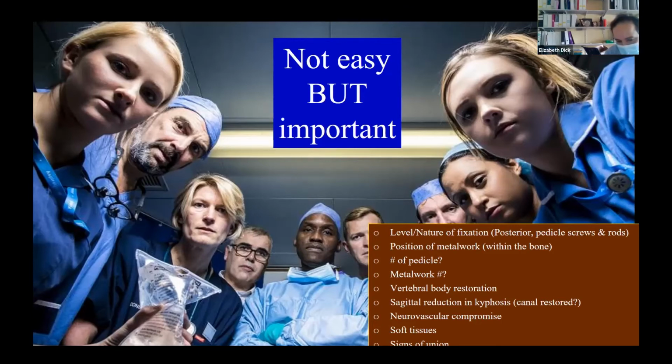And so you have to adopt strategies to put cement in when it's safer, when it's beginning to get a bit more solid, and that's why we use slightly higher viscosity cement. We put it in late. But yes, in terms of damage limitation, when you're putting the cement in, it's done under fluoroscopic vision with live imaging, so you're as careful as possible. As soon as you detect the cement has gone in, you tend to stop, have a chat with your anaesthetist, and make sure the blood pressure, the breathing, and the patient's vitals are okay before you carry on. But don't stop.